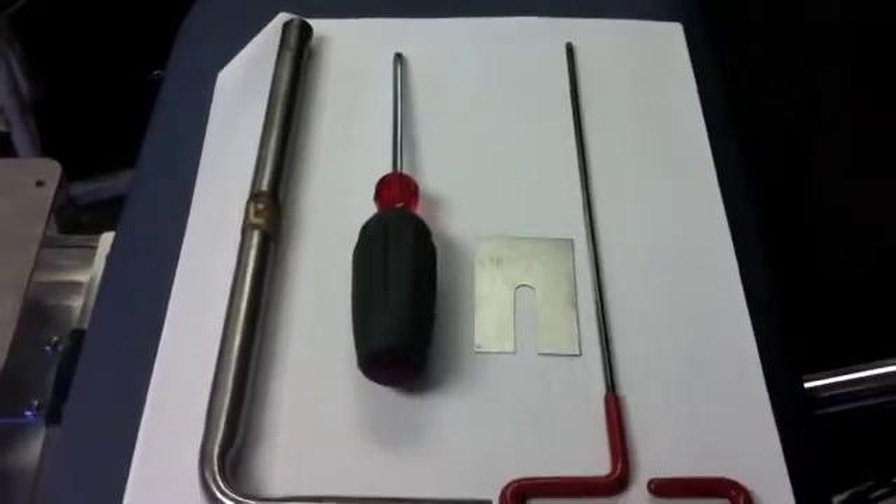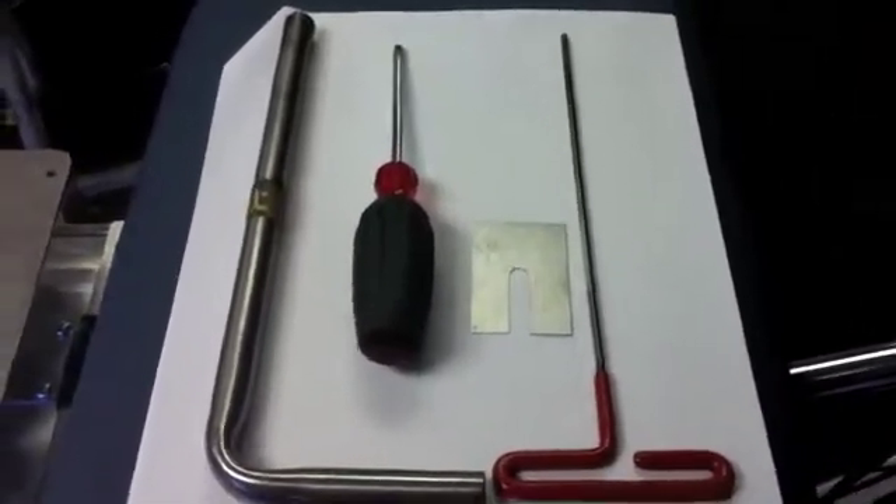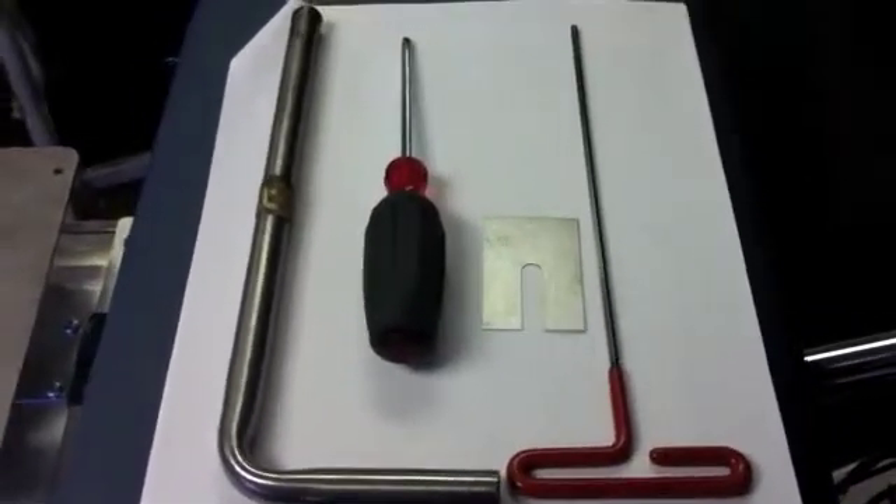This instructional video has been prepared to show the activities related to a trumpet valve cam adjustment on the Zenith Thompson table.